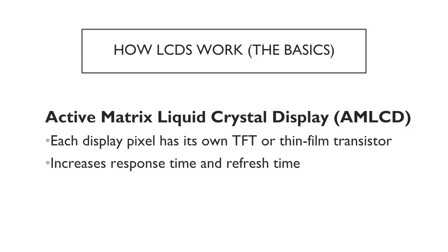One thing to know is that LCD monitors can be damaged if touched too hard, since only a flexible cover is between your finger and the liquid crystals. You may notice a change in appearance when the screen is pressed. Make sure to avoid applying pressure to these monitors.